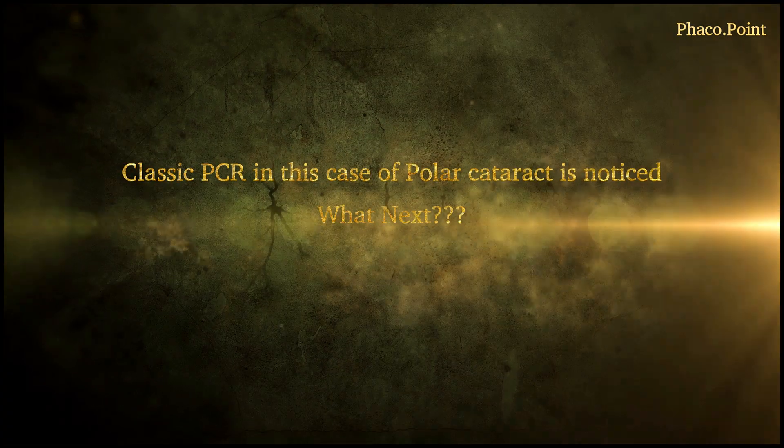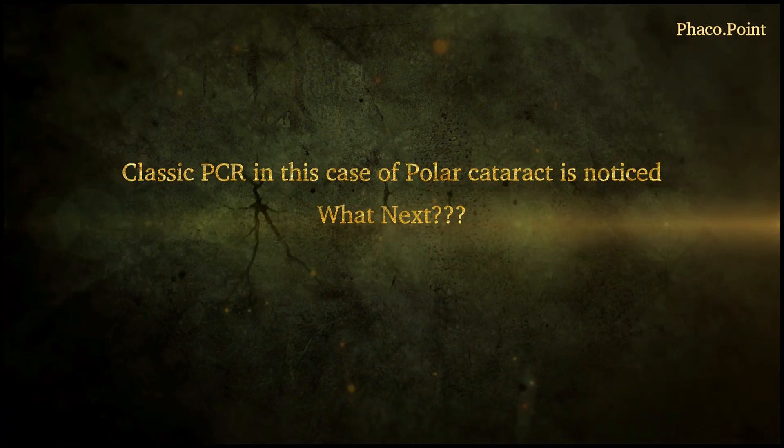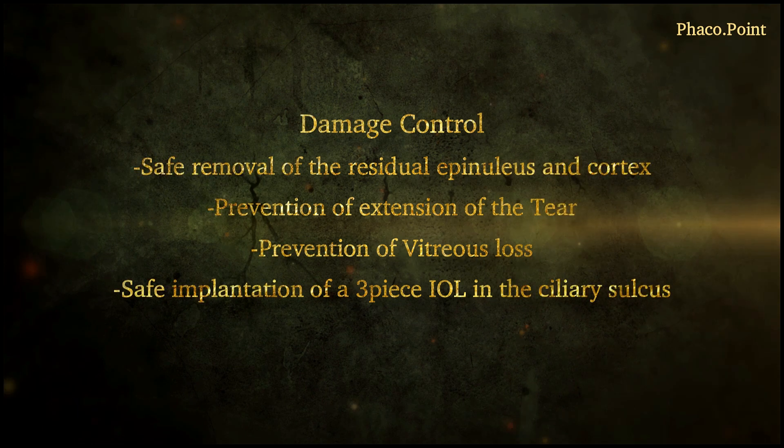Now you've noticed the PCR and you still have some epinucleus in the eye. What's the best way to manage this patient so that we can limit the damage to where we are now, not make matters worse, successfully remove the epinucleus, prevent the disturbance of vitreous, and safely manage to implant an IOL within the ciliary sulcus.